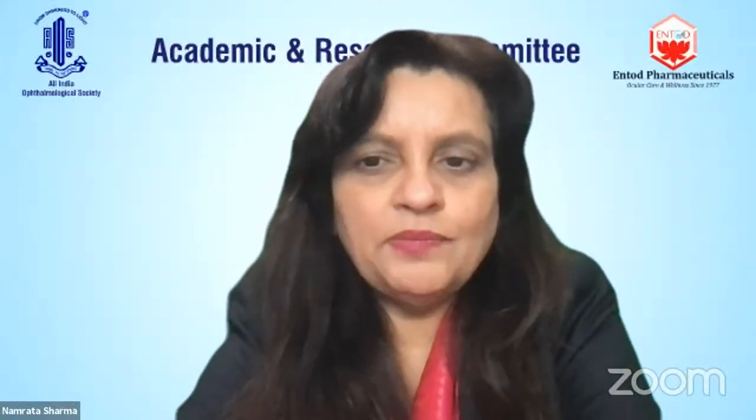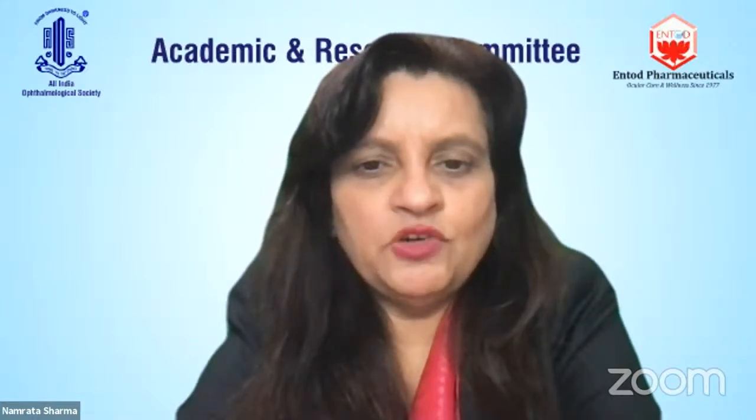In the olden times, you would have to adjust all the other parameters. In new phaco machines, we don't need to adjust all this. And one other very simple thing, Kumar, I don't know why you said that you wouldn't do it. I would still do a bimanual like he did for a small pupil, because you can't see the cortex.